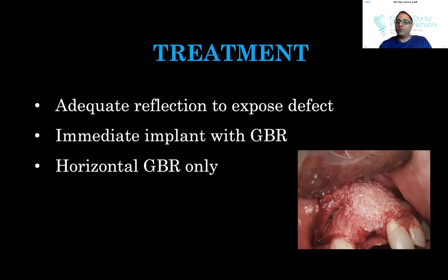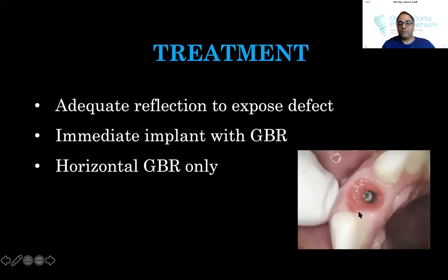So how do we treat it? Well, you need to reflect it. You got to expose it, and then you have to graft it, right? Whether you're doing it with the implant the same day, which is what I typically advise and recommend, if you feel comfortable to do so, or you just do grafting only. Okay, so this is the same case with that anterior that I showed back there that ultimately led to a large apical concavity, and then we just wound up grafting the entire thing. So I think that's important to understand. And then this is the post-op. Again, you can see nicely grafted, good soft tissue volume.